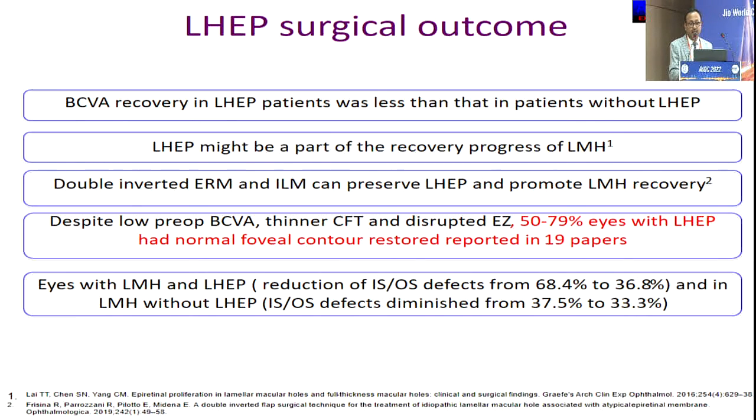In eyes with LMH and LHEP, we have seen a reduction of the IS-OS defects, which was more compared to patients without LHEP, because photoreceptor abnormality was less in the second group.